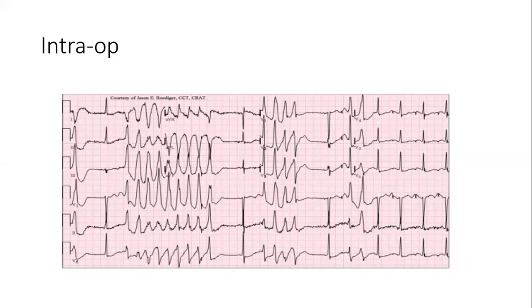No. I actually thought about it, but it wasn't so classic of the turning points. And then I thought either it's ventricular tachycardia, but the turning points are not so classic. Thank you. But a Torsades de Pointes is a ventricular tachycardia, a polymorphic ventricular tachycardia. But unfortunately, for exam purposes, if you don't say it's a Torsades, you need to mention that part, that it's a polymorphic ventricular tachycardia.